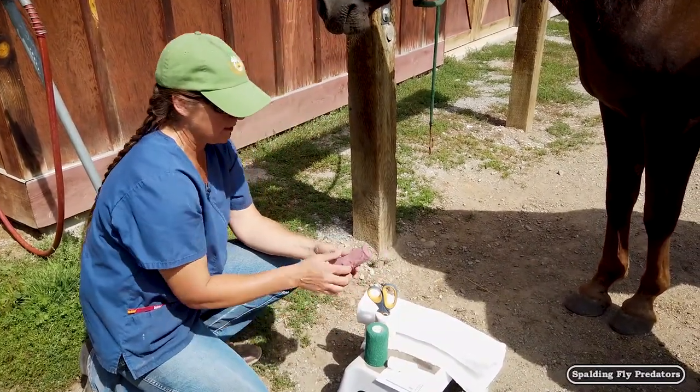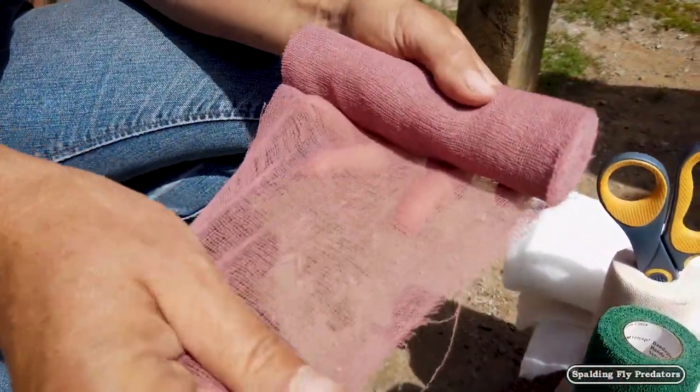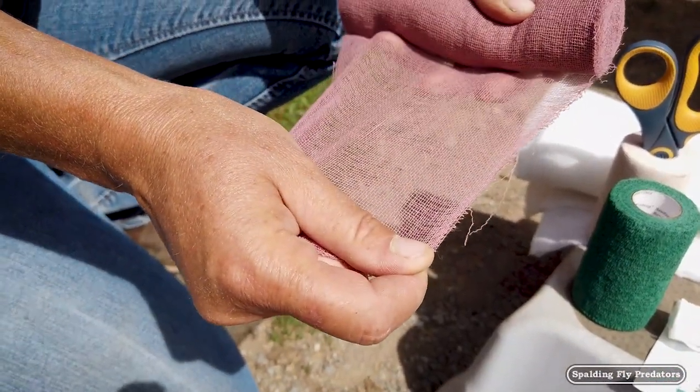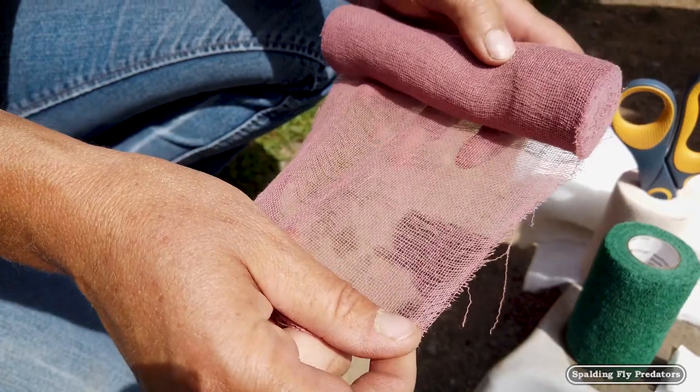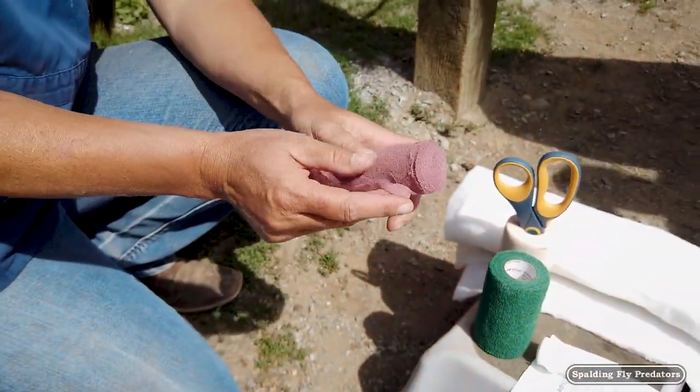This next layer is like our pantyhose. It's not as stretchy as the white conform, but it's going to go over the top of the cotton and smooth all of that area out, allowing us to make sure that there is even pressure from the top of the bandage to the bottom of the bandage.